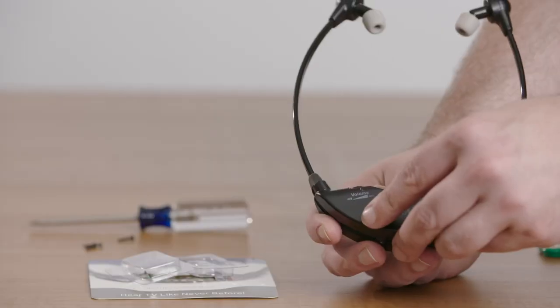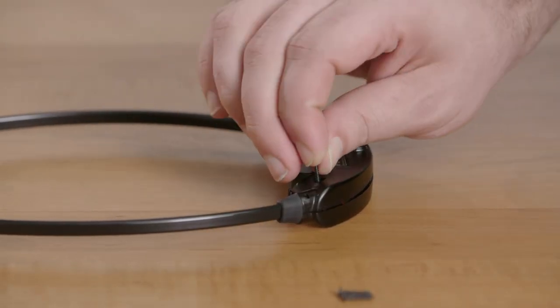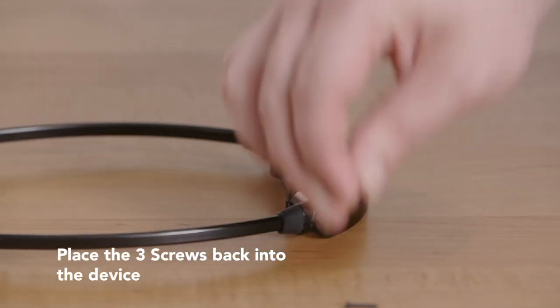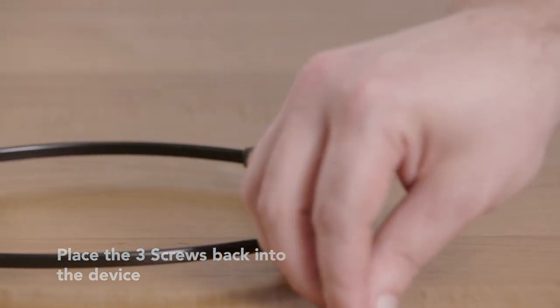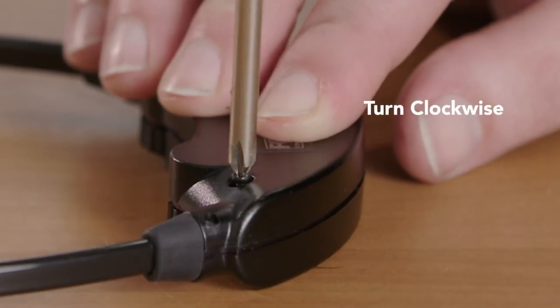Once we have it in like that, put the plate back on and screw it all back together. Just like we did before, we're going to put the three screws back in the three holes once the plates are lined up, and this time we'll screw them in to put everything back together.